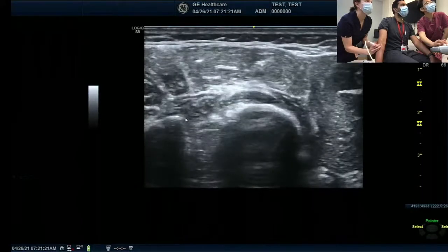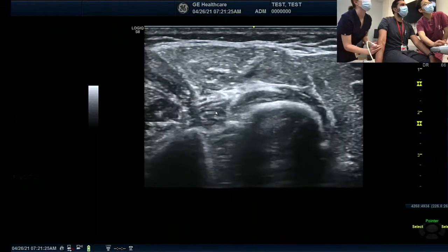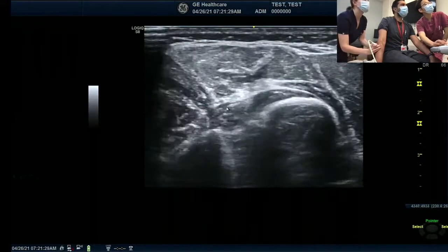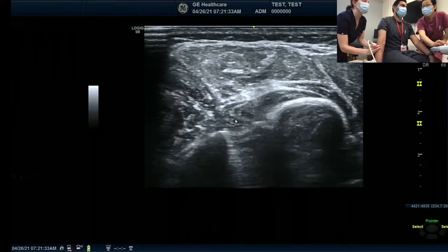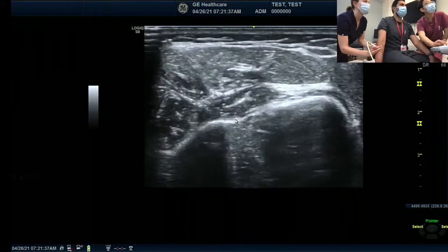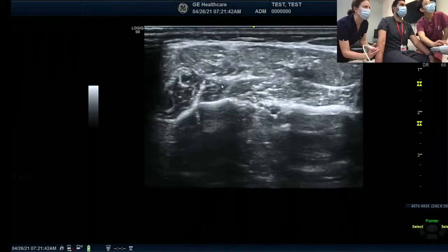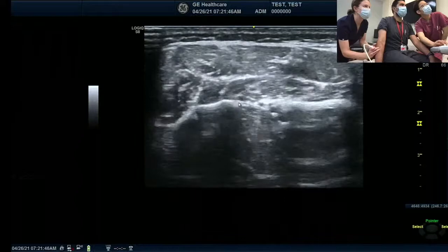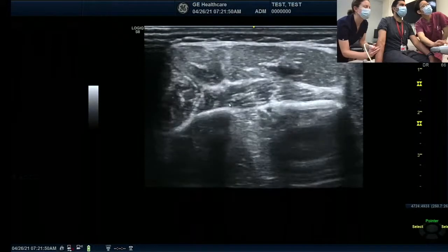Almost. Look at this. Now, when the supinator is almost gone, APL is popping out, and the radial nerve is going into here. This is the radial nerve above the APL, right? Good. And then move down continuously. You can see the two APL branches. So that's the posterior interosseous nerve. Then look here, see, one and two. I'm going up and down.